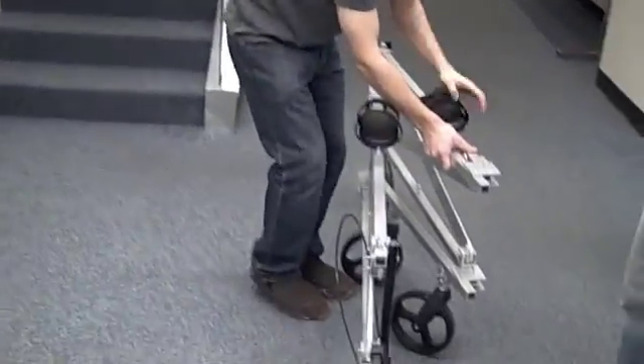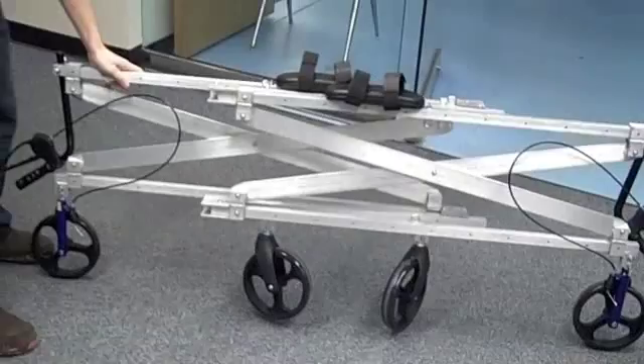By incorporating these two folding mechanisms, we're able to create a device that can fit into a much smaller place than any other gait trainer on the market.